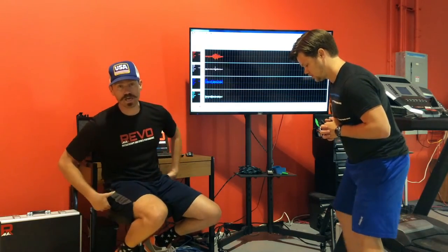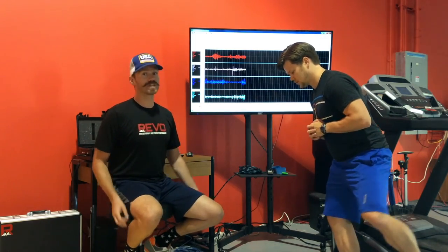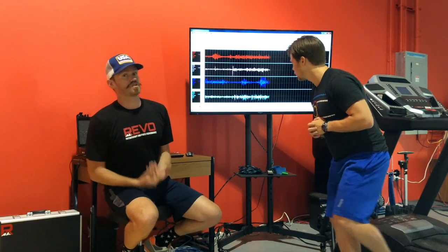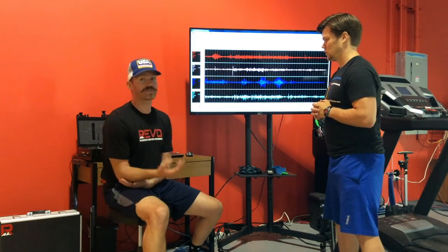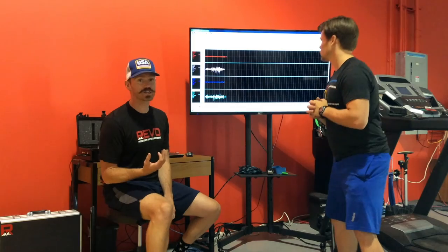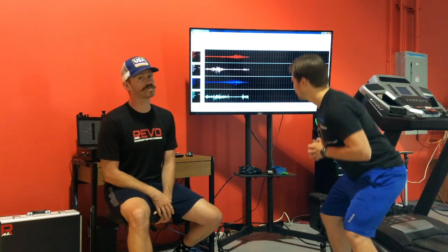Smaller muscles like the adductors, short rotators of the hip, and small musculature in the lower leg are where we see a lot of overuse injury. Not only is this a great way for us to assess your patterns, but we use it while we treat as well.